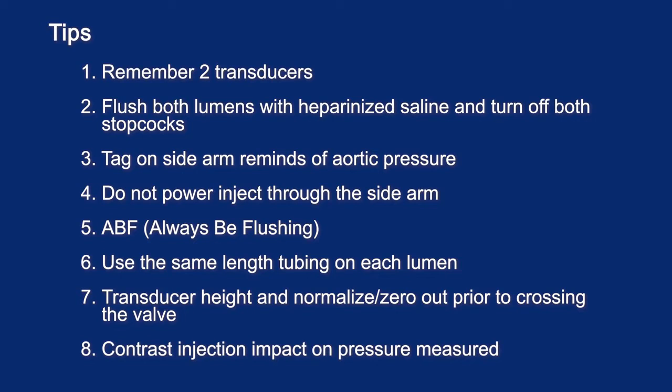Be aware that contrast can impact the pressure measured. If you take an LV angiogram before pulling back, this may impact your pressure readings. Make sure to flush after all contrast injections.